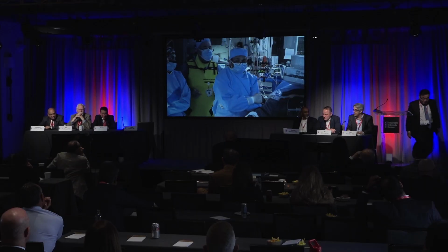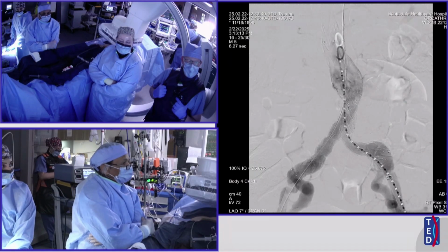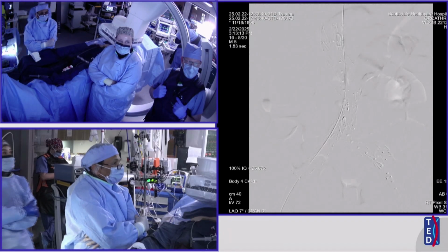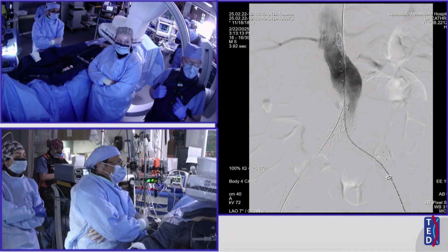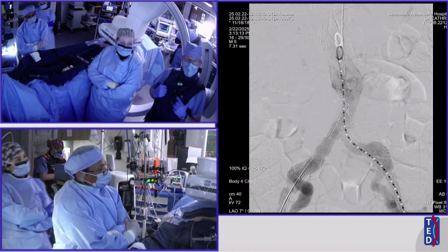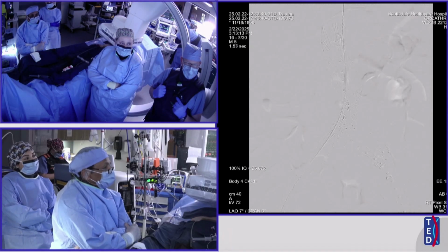Yep. So we ballooned this, and we kept it up for almost a minute, and we ballooned distal too. I think there are 2 lumbars there too, but I think the final angio, as you're seeing it playing, shows the graft has landed perfectly. It's a very diseased neck at the level of that left renal, right renal. And I see the leak is actually almost gone completely. So I'm going to stop this. I think with the reversal of heparin, this will seal off.